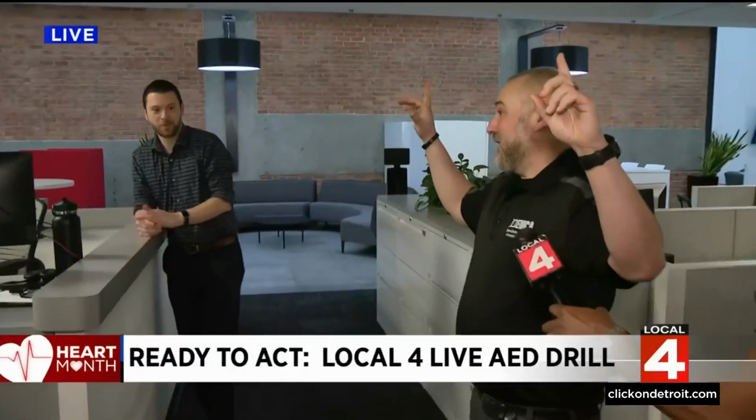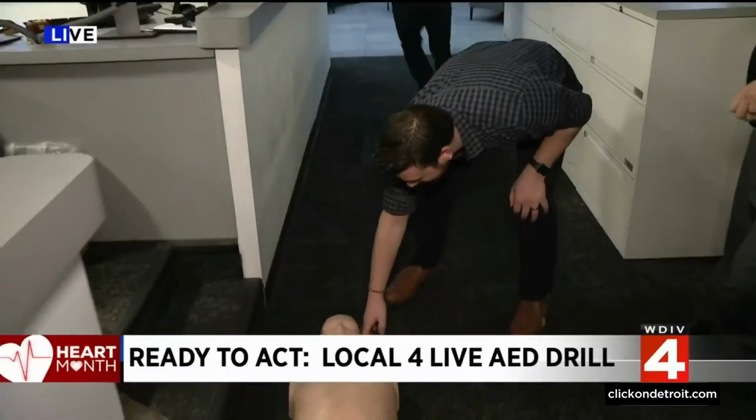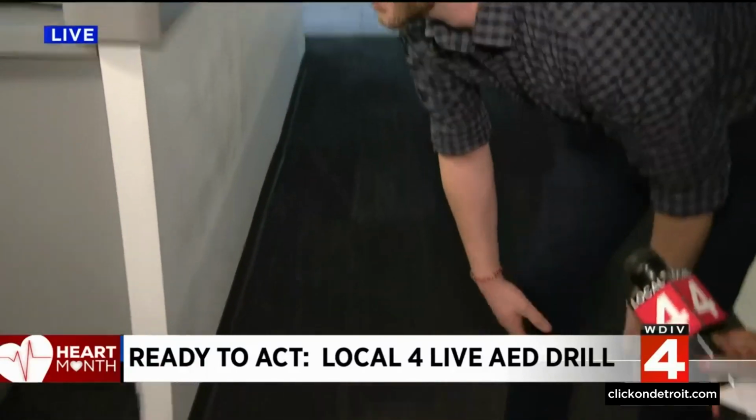I need some help over here. I'll get the AED. Sir, are you okay? Sir, are you okay? He's not answering you. Are you calling 911? Call 911. Ready?